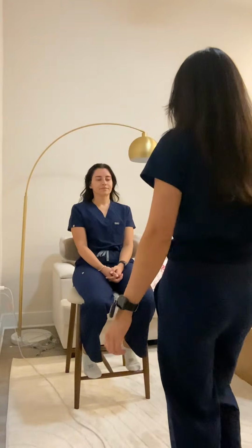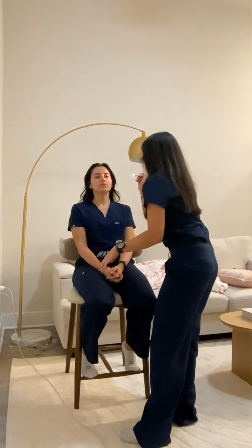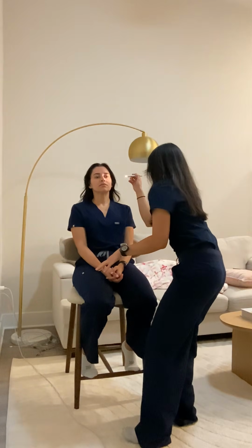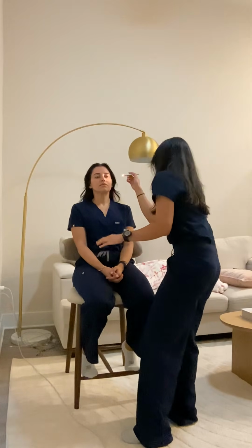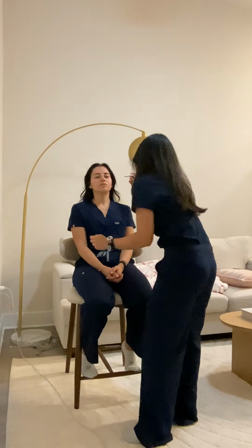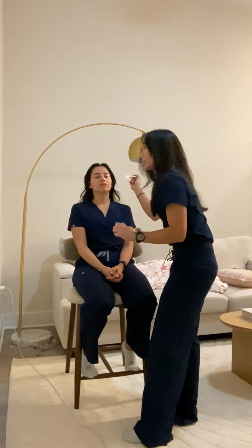Wonderful. Next, I'm going to be checking for tangential lighting. Now I'm going to shine the light to visualize the cornea. I'm also going to be assessing the anterior chamber, the depth of that anterior chamber, as well as noting any crescent shadowing in the medial aspect of the eye, and I'm going to perform that bilaterally.